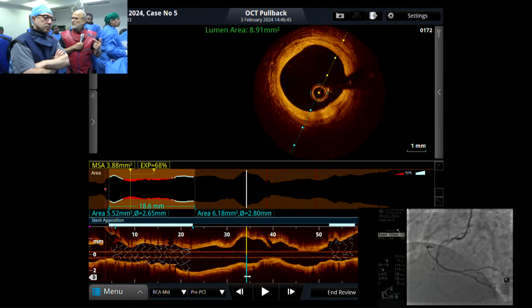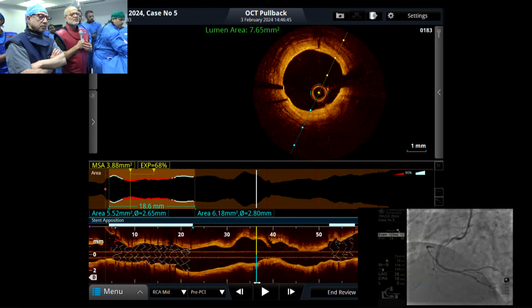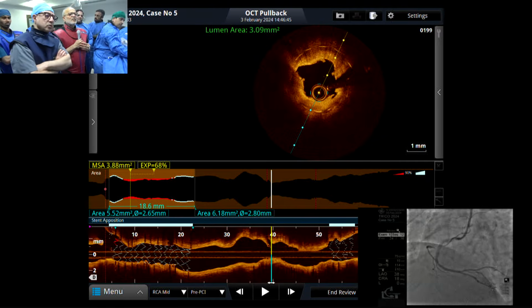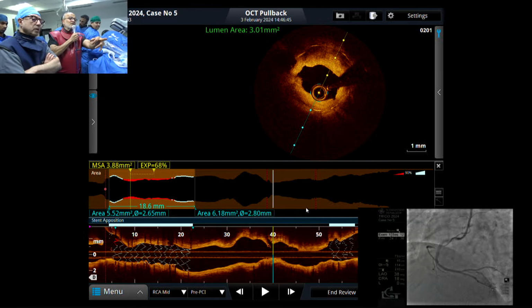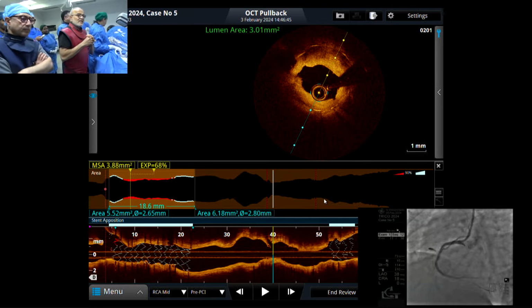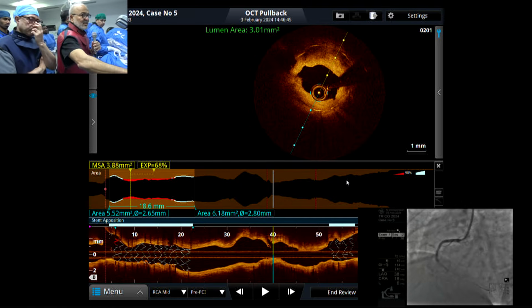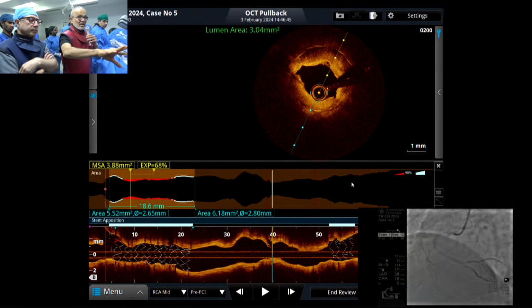3.25, 12. Yeah, non-compliant. If not, bring the 3.5, non-compliant. And what's there? We can do a 3 at a high pressure. Because I tell you, this is a healed plaque. Distal inflation was only at the periphery, where there is atheroma. A 3 at a high pressure will work. It is heterogeneous.